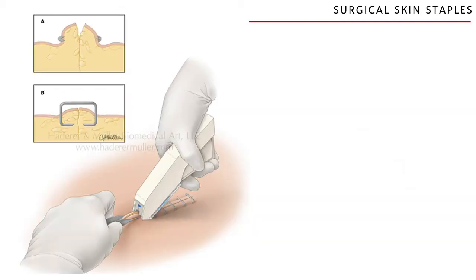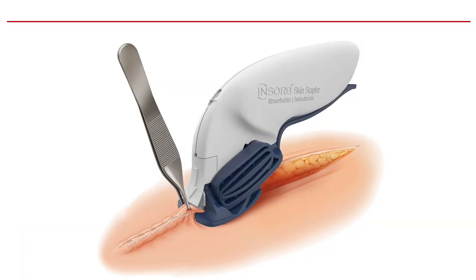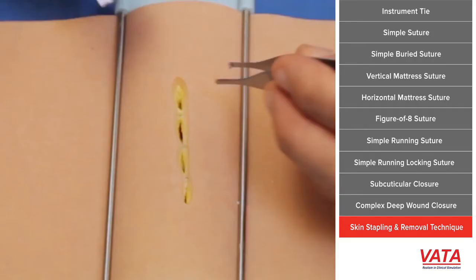So this is how it's done. As you can see here, you put the two skin edges together, and then the stapler brings them together. You need your thumb forceps for this.